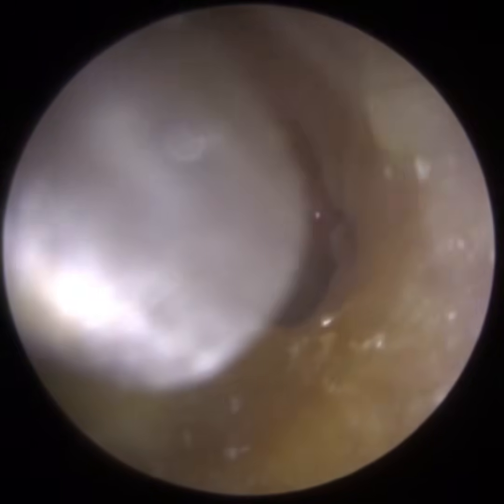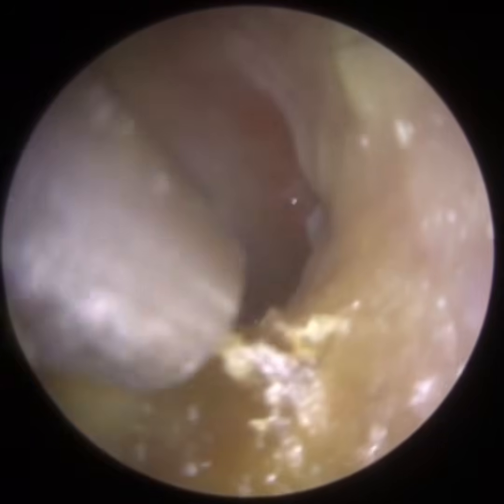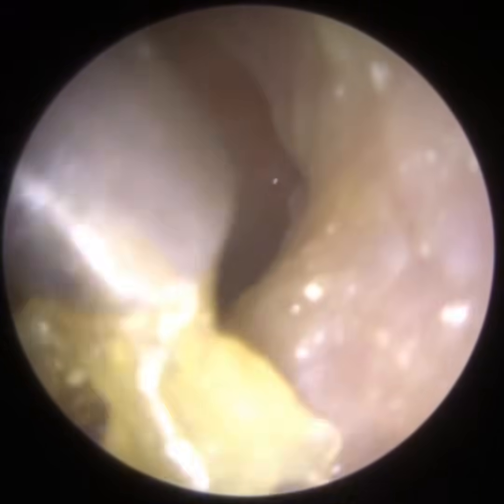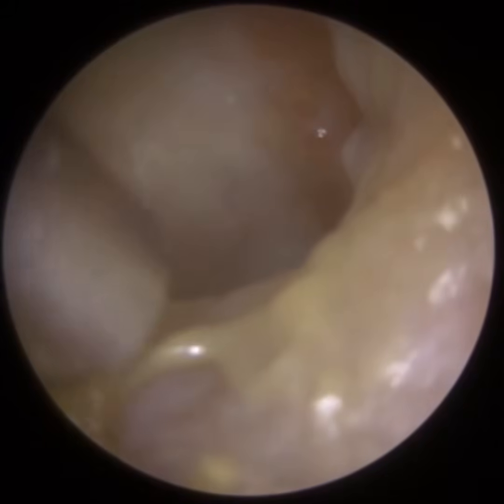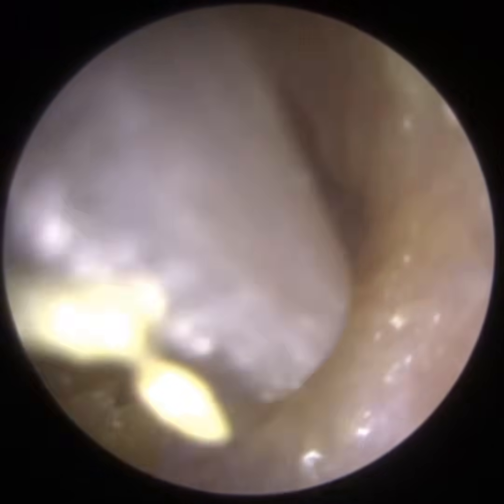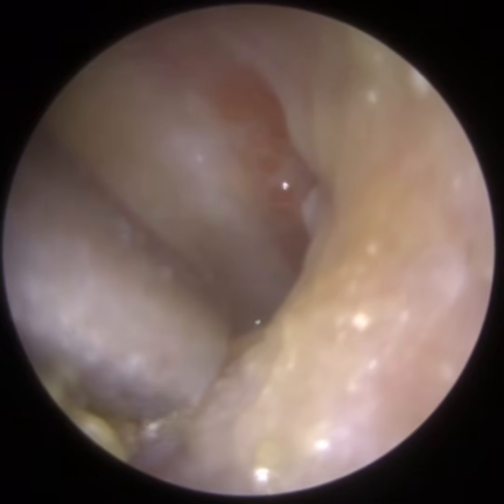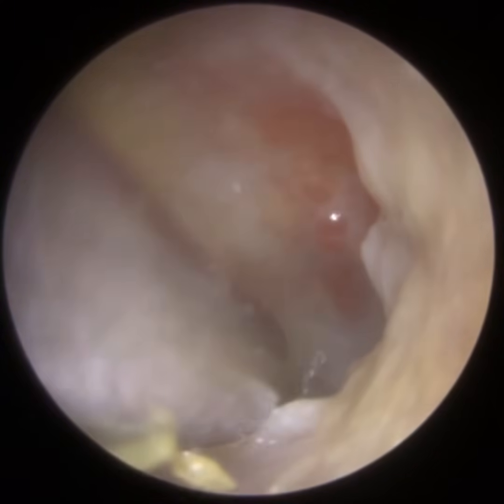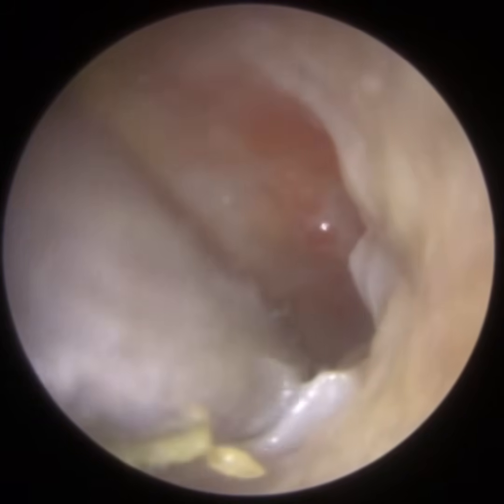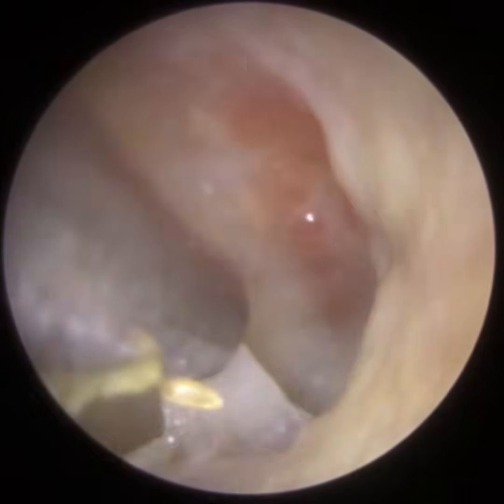Granulation tissue not only occurs in the ear, it can occur in other parts of the body, but it occurs when your body is trying to heal from an infection or trauma. In this case, the patient has got a natural infection of the eardrum because of the otitis externa. Granulation tissue is a buildup of connective tissue that then has its own blood supply. So you get a buildup of blood vessels within the connective tissue, and it gives it this bumpy red appearance, and it can be quite wet.